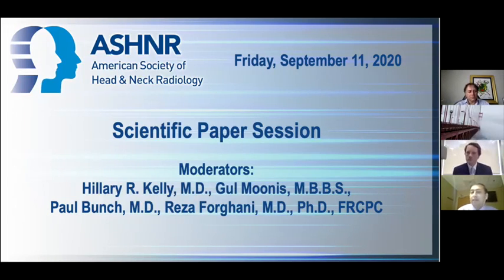What we wanted to show here was that even without really thin slices, the radiologist was able to predict the depth of invasion to a reasonable degree. And we would expect that if you actually used a lot of thinner slices with the intention prospectively of looking at depth of invasion, you would probably get a lot better correlation, and probably better correlation with thinner tumors. So this was almost like an exploratory study where we wanted to see if it could even be done using CTs and even PET CT, because there's very limited data on that.